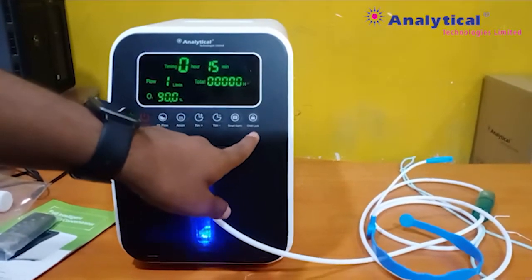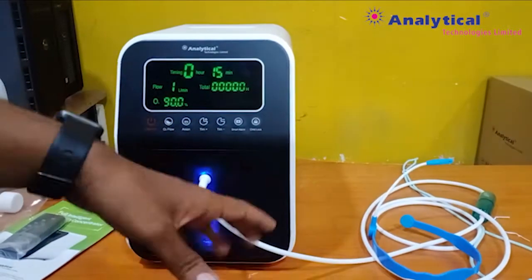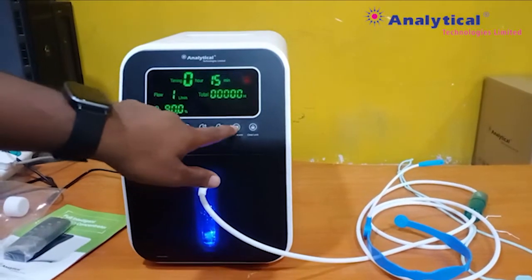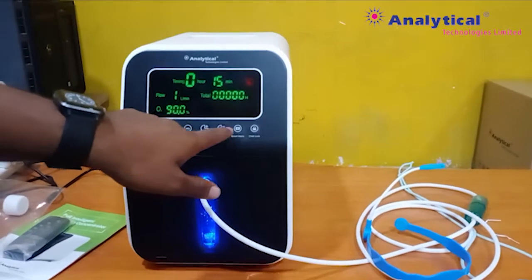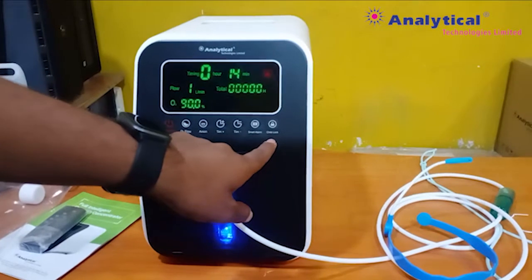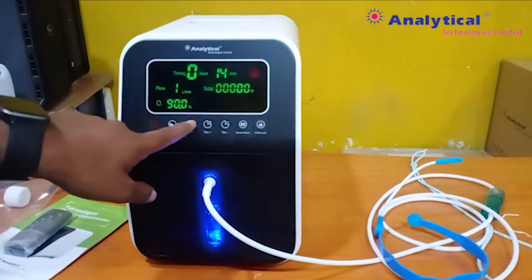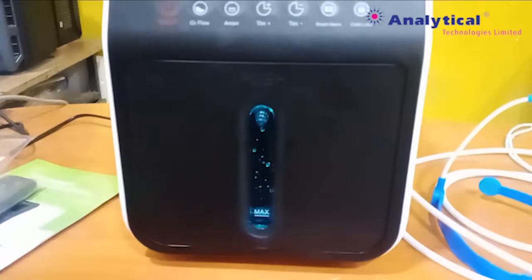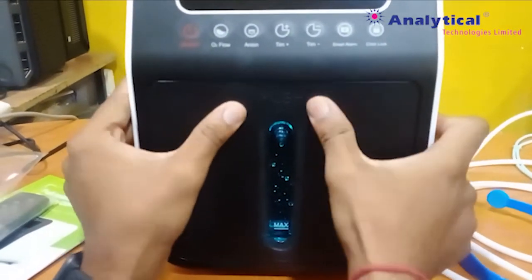This is the extraordinary function: child lock. If you have any child or something like that, then you can lock by this point. Then you cannot touch any button or use any functionality. This is the child lock function. If you activate child lock mode, then you cannot press any button. You can open it like this.